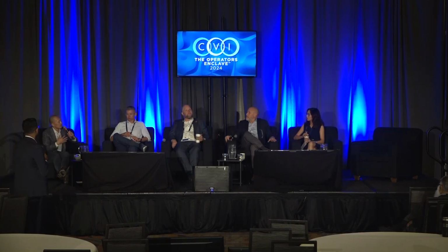And everybody would close this with an AVP2, or would you use something different? I think the AVP2 is the easiest to position because the 3 lobes give a little bit of forgiveness, and you can give contrast on the way out to see exactly where you are. But has anybody closed it with something else besides AVP? I've tried ADOs before, but I do like the AVP2 better.